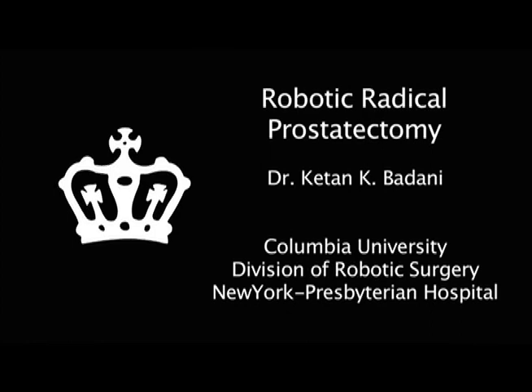This is an instructional video of the key steps of robotic radical prostatectomy. I'm Dr. Kathan Badani, and I will be demonstrating to you my technique.